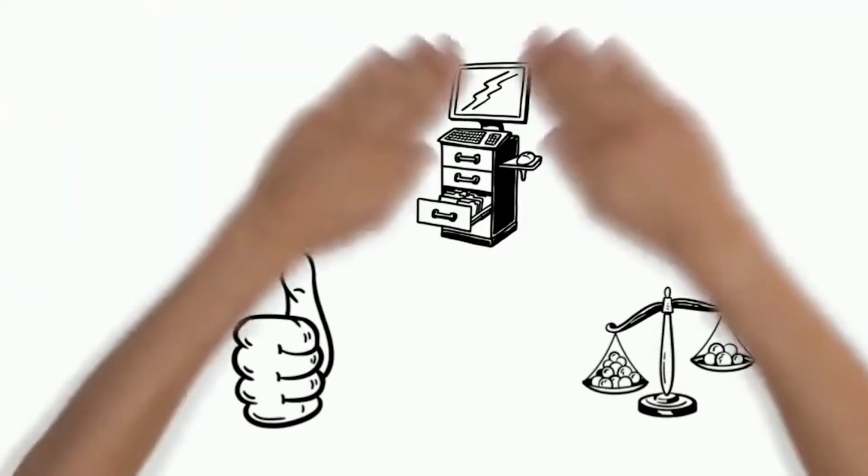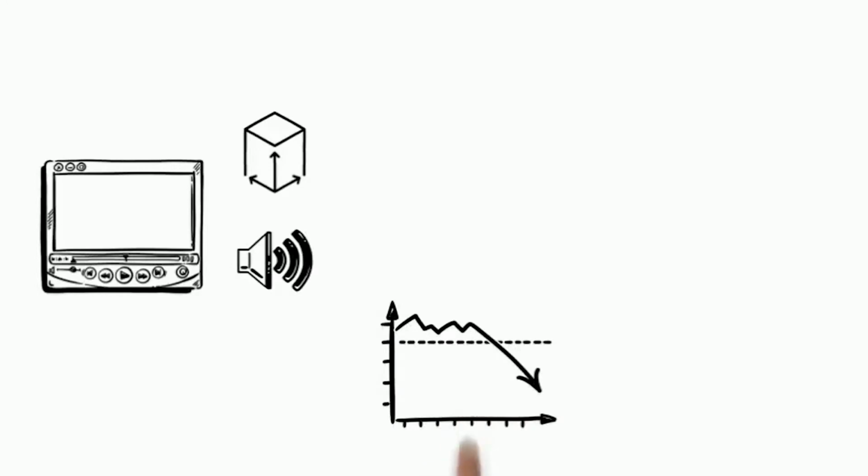During the training session, the participant stays attached to the electrodes and watches, for example, a movie that is changing the size of the screen and volume of the audio. This depends on how much of a specific activity is pronounced in the brain, which is determined by exceeding or falling below a certain level of brain activity. If the size of the screen is getting smaller, a specific brain activity is too weak. If it's getting stronger, the screen will be getting bigger and the sound will be audible again.